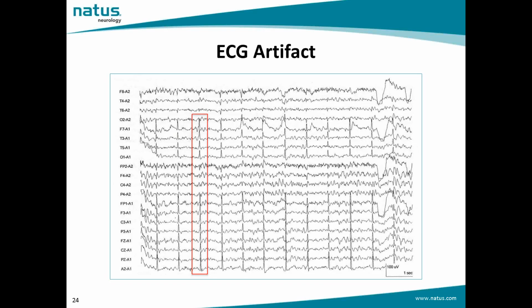Generally, in babies, the EEG recordings are free from ECG artifacts. But sometimes, especially during ambulatory sleep recordings, when the head of the baby is placed on the left arm of the mother, the ECG activity of the mother can be reflected into the EEG signal of the baby.